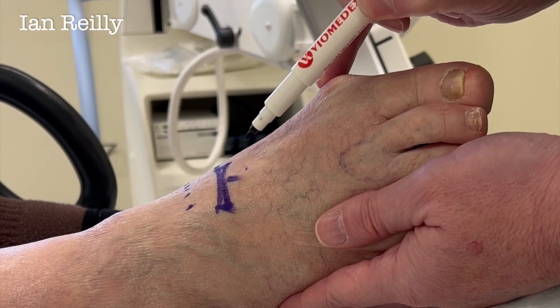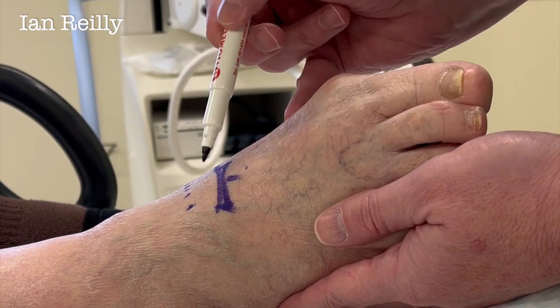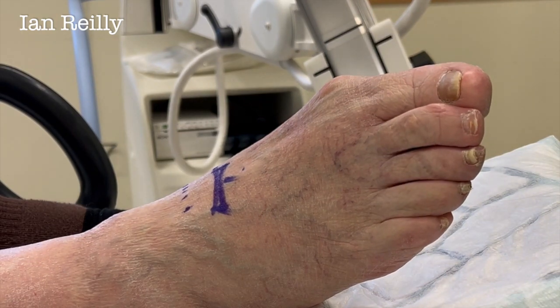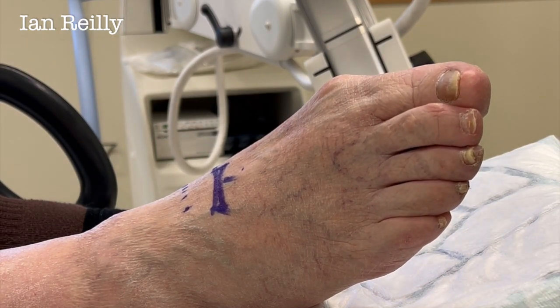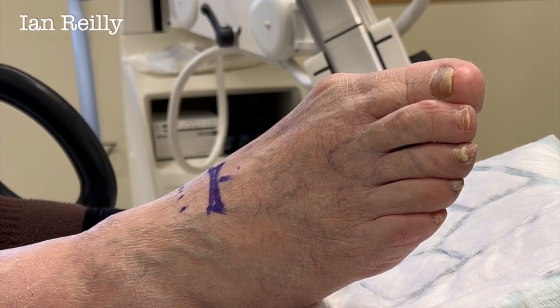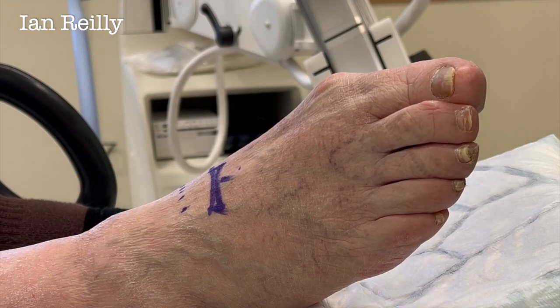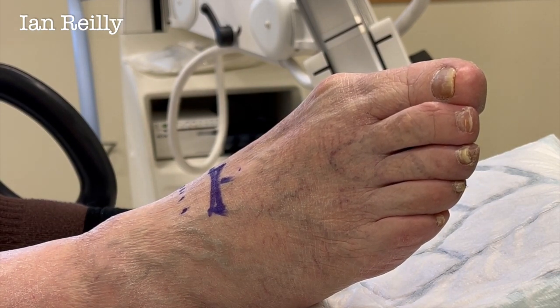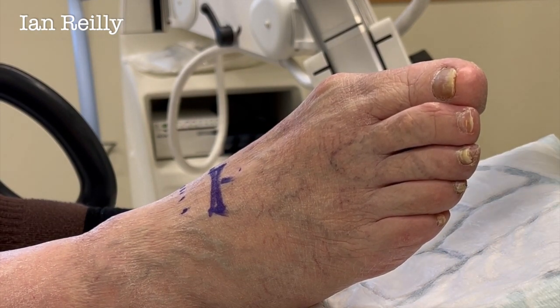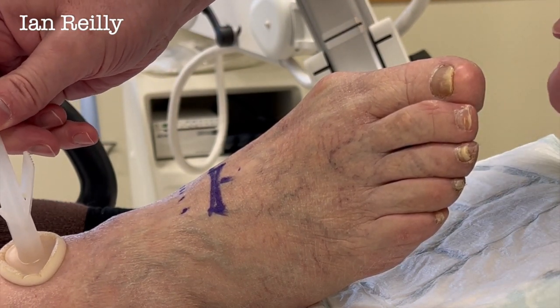So what we're going to do is a little injection. Have you had one of these before, Chris? Yes, I've had one in the foot and one in the ankle joint. Can we just turn the aircon off for a bit? It's a bit loud, isn't it? Right, let's just give you a little bit of — oh, I can actually hear myself think now.